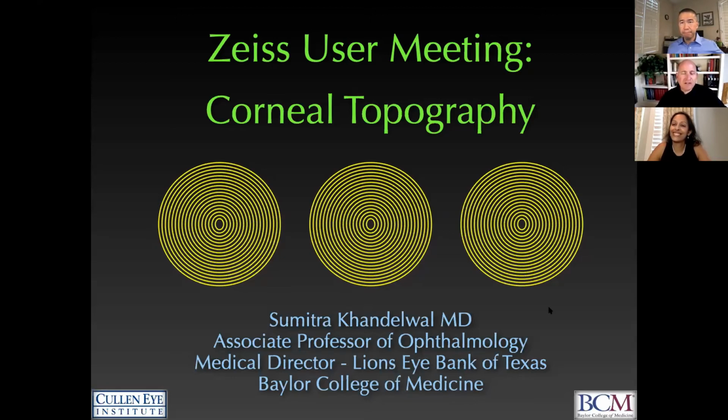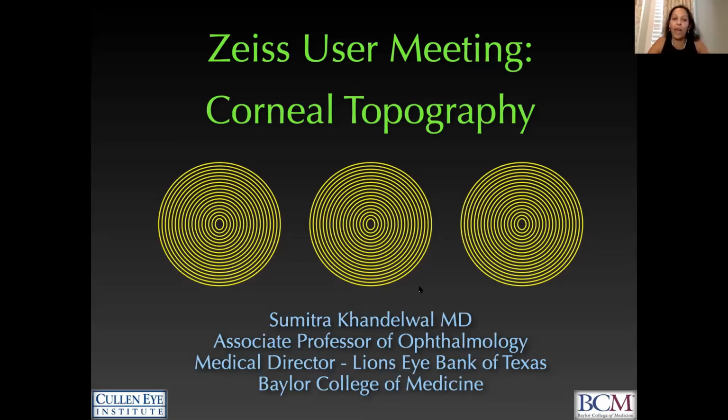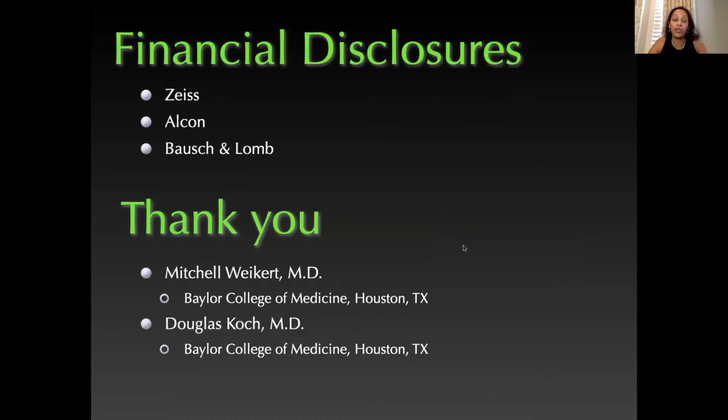So Sumitra, let's talk about the other part of the equation, which is corneal topography. Demystify this for us. Absolutely. Well, I think this is also a great segue because, as I said before, there are definitely surgeons out there, more so in the past, that have not always utilized topography as a screening tool. But I think it becomes even more important, not just for those eyes that are interested in toric lenses, but also for those that are interested even in a monofocal lens.